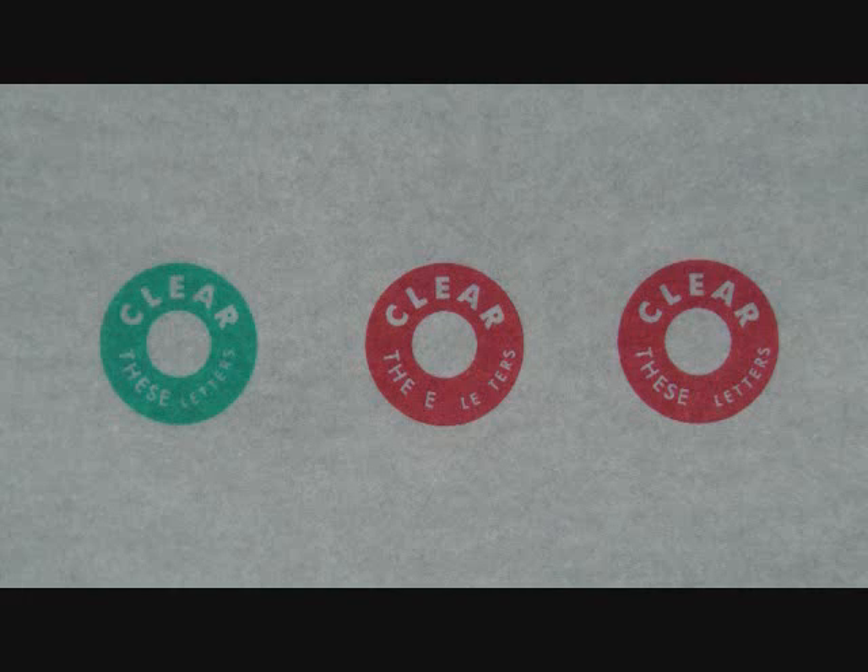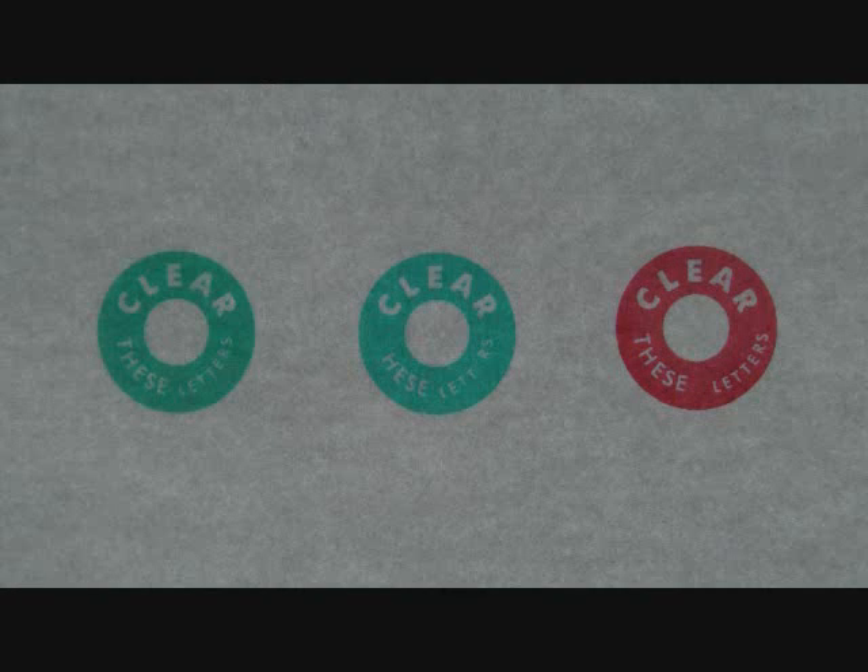You will also notice the words 'clear these letters' will have missing letters if suppression occurs. If you see two greens and one red, your brain is turning off the input from your right eye, and you do not want this to happen. The words 'clear these letters' will also have missing letters if this suppression occurs.